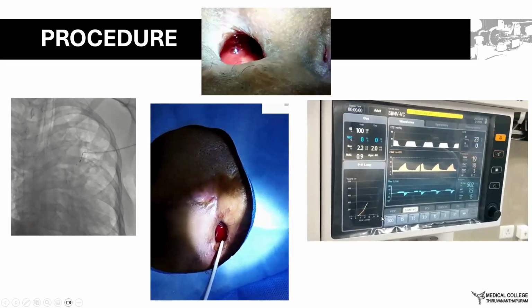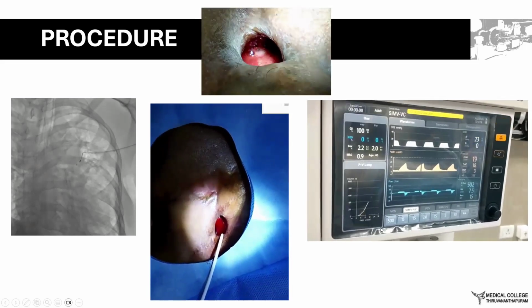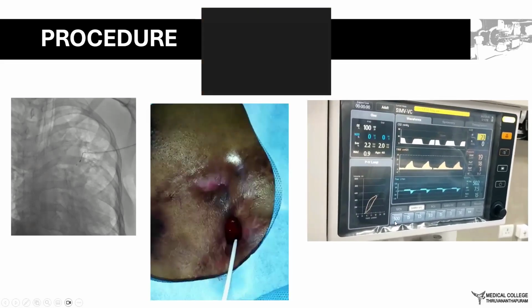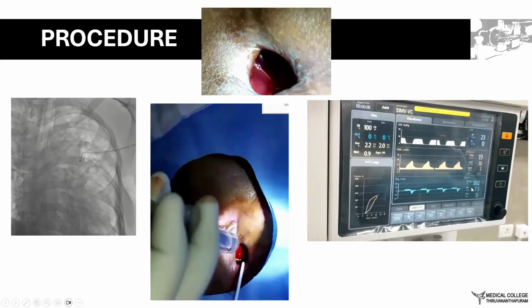Second thing that objectively we can tell there is no air leak is what is the tidal volume that is set by the anesthetist or by the anesthesia workstation into the patient, and what is the tidal volume that is the expiratory tidal volume.